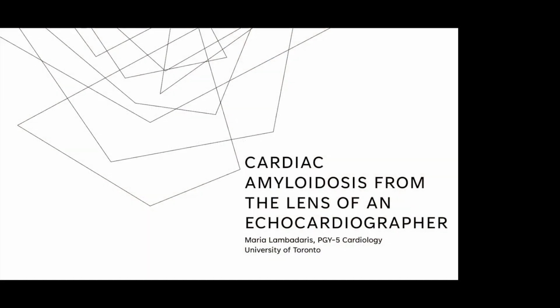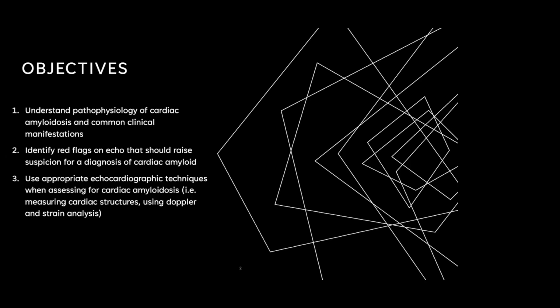I'm Maria Lambadaris, one of the C2 cardiology residents, and I chose to present on cardiac amyloid today for the echo rounds. The objectives of today's talk are, number one, understanding the pathophysiology of cardiac amyloid and the common clinical manifestations; to identify red flags on echo that should raise suspicion for diagnosing cardiac amyloid; and then how to appropriately use echographic techniques when we assess a patient for cardiac amyloid, for example, measuring structures appropriately using Doppler and strain analysis.